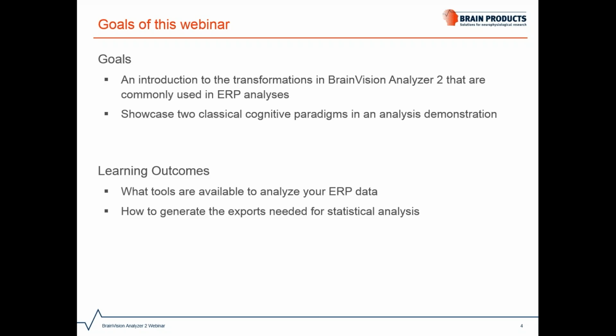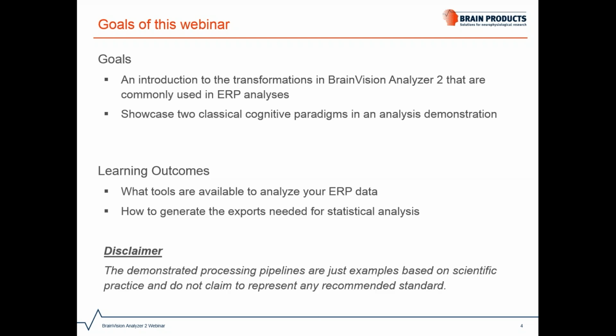What I hope you will take home from today's session is, for once, that you get an overview of important tools for ERP analysis, and also that you learn how to extract data from Analyzer for your statistical analysis outside of Analyzer. Please note, though, that the pipelines I will show today are just examples and do not claim to fulfill any recommended standards. Of course, they are based on scientific practice and guidelines, but I want to point out that every dataset is different, and therefore also every analysis is different and needs to be adapted to the requirements of the data.